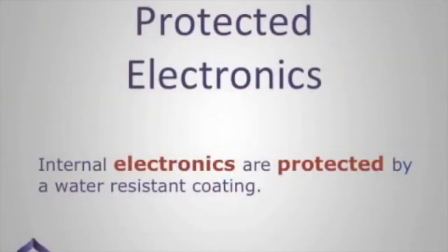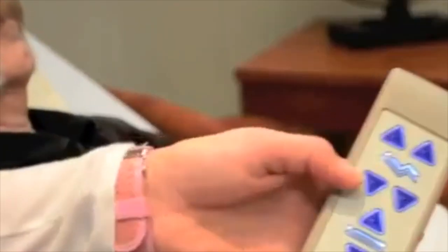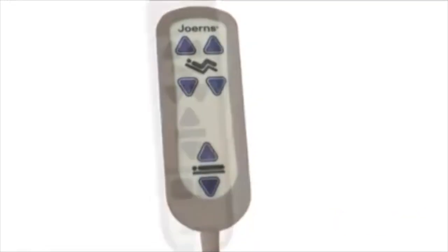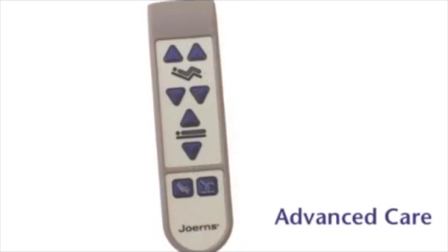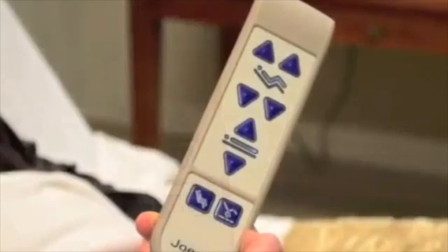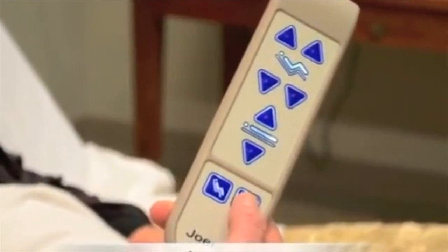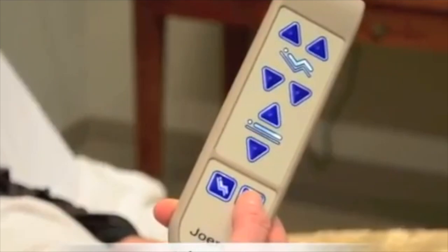The internal electronics are protected from liquid damage by a water-resistant coating that seals the control device. There are 2 different styles of hand pendants: Standard, which has 6 buttons of operation, and the Advanced Care hand pendant. This pendant includes 2 additional buttons at the bottom. We will discuss Advanced Care options later in this video.